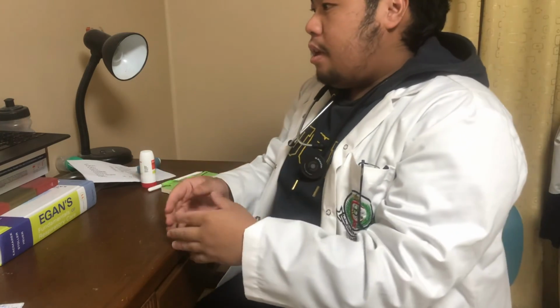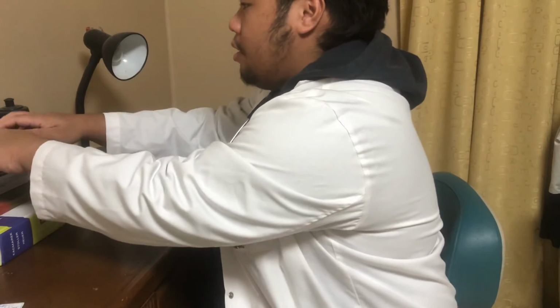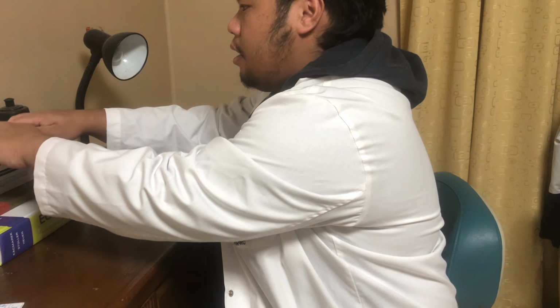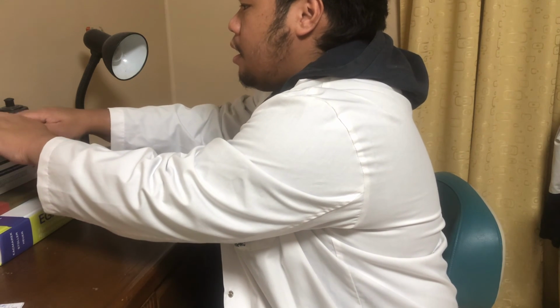Finally, we are at the part of documenting the data and proving that the patient is actually capable of having better lung capacity after the MDI administration. This shows a summarization of the tolerance of treatment and the care and response of the patient to the treatment. So that's it for our RD for the MDI.